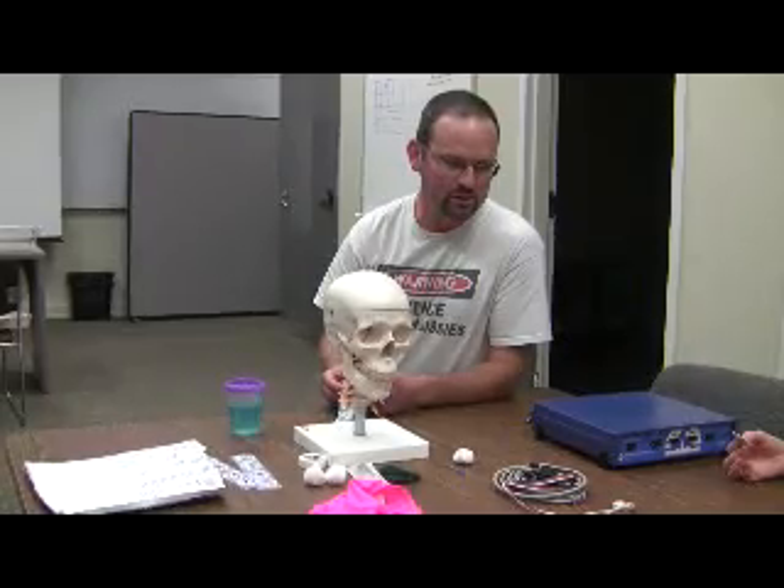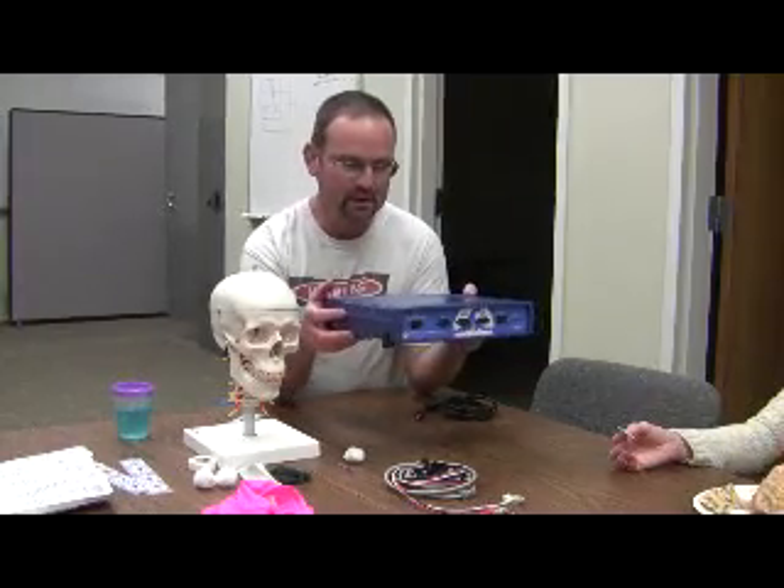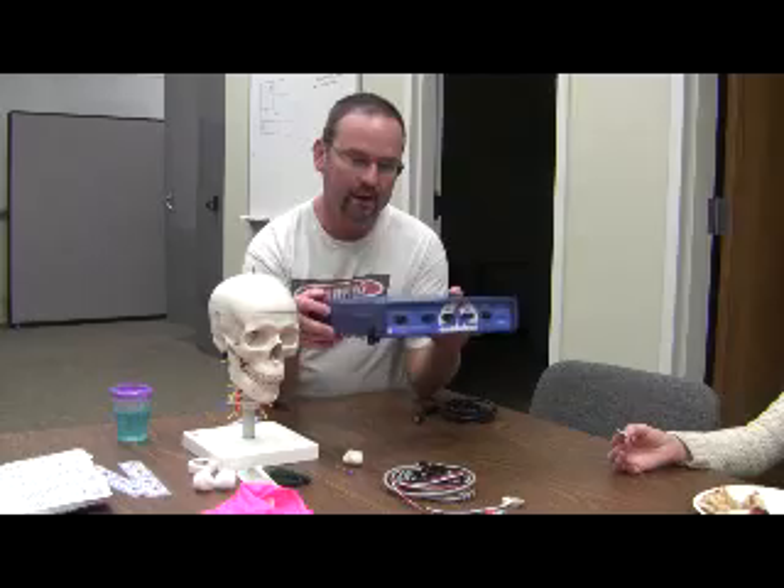I'm going to give an introduction to using the BioPak amplifier. This is an MP36 — I like to call it the blue box. It's a four-channel physiological amplifier.